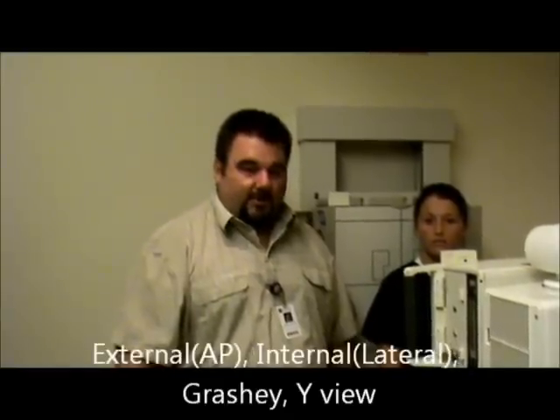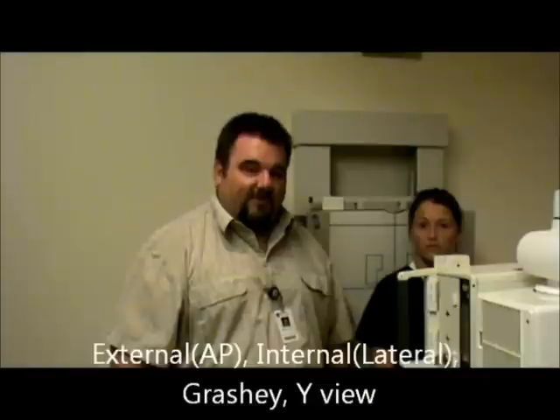Today we're going to be doing our shoulder X-ray. The four views that are most commonly done here for the shoulder are internal rotation, external rotation, Grashey, and a Y-view.